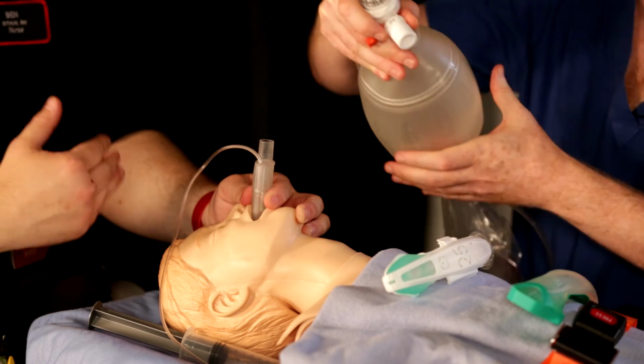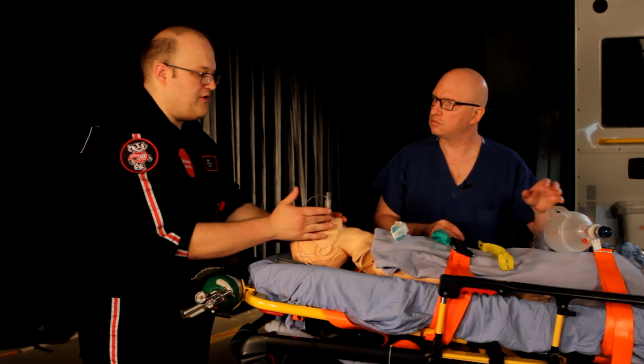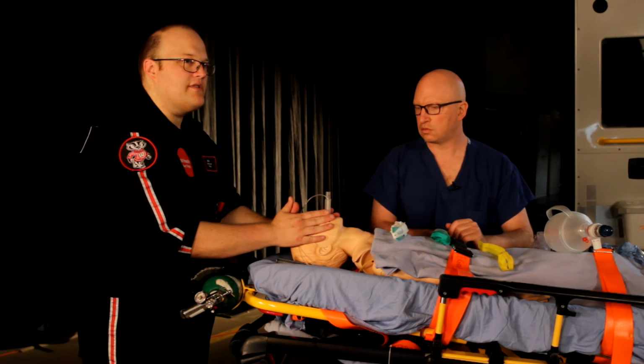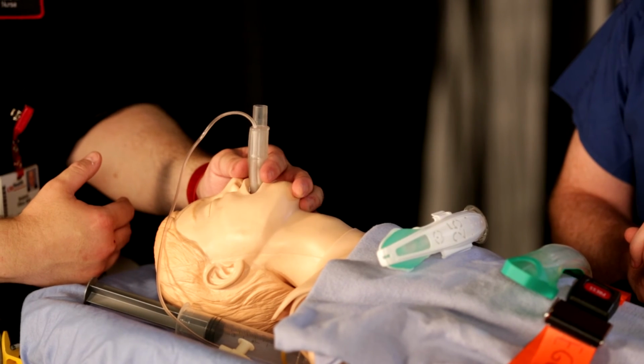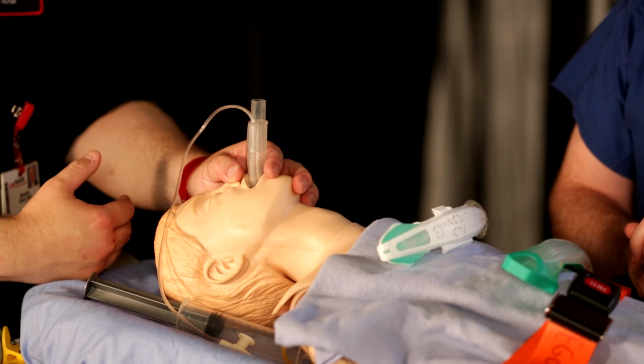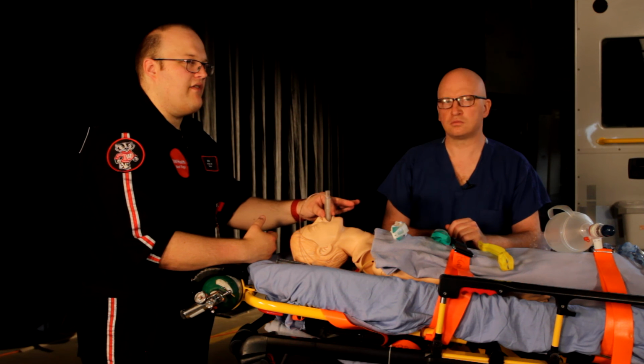With both of these devices, you want to know what your securement plan is. So there are some commercially available options, essentially rubber bands that kind of go around and secure it, or kind of the old tried and true is just tape. And so a lot of people will tape them. Some people actually will just leave them in place and have one person's job to hold them. Remember that it's not a secured airway as far as an endotracheal tube, but this is considered an advanced airway, and you can ventilate successfully through these devices if you need to place one.